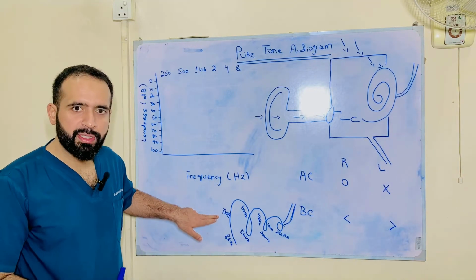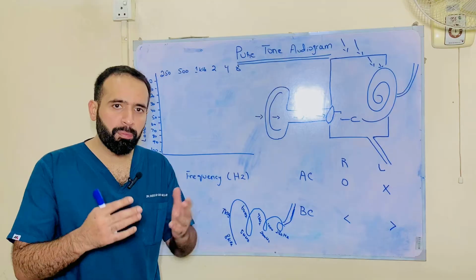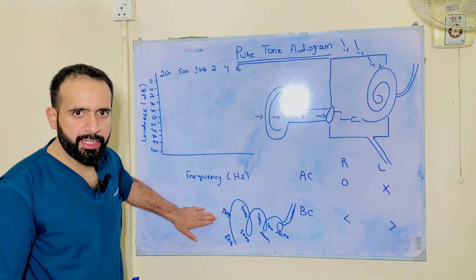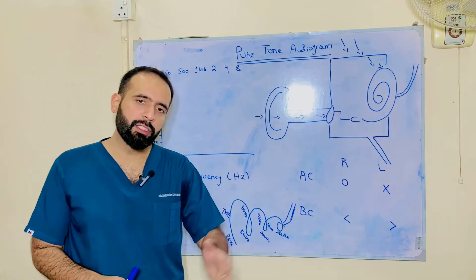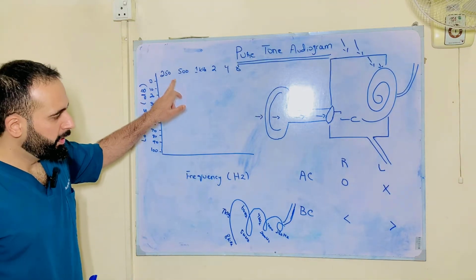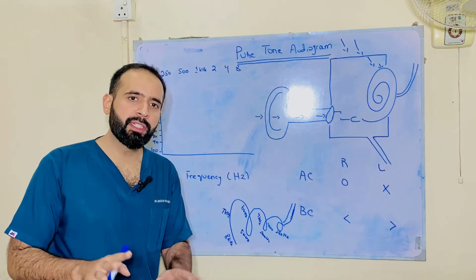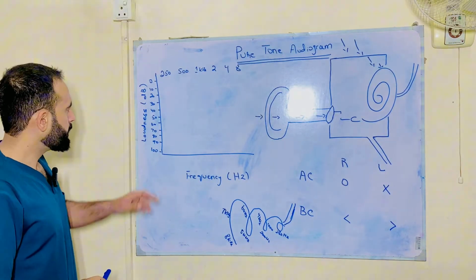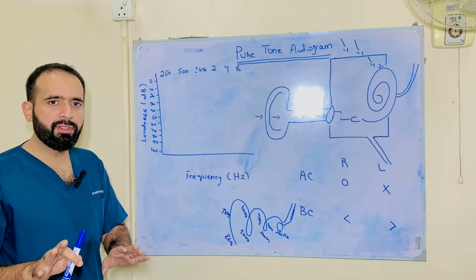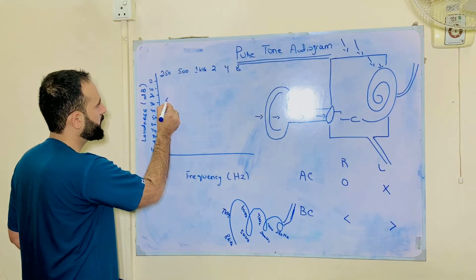So whenever there is cochlear damage, the higher frequencies are going to be the ones that are compromised, with the lower frequencies being relatively spared because the damage in majority is happening at the base. So let's take this patient and see the audiogram. We start off with 250 hertz. Remember that the 250 hertz, since it is present further away from the base, is going to be relatively spared. I select 20 decibels or 30 decibels. Since it is relatively spared, the hearing at this frequency may be preserved. So I will mark a point here.